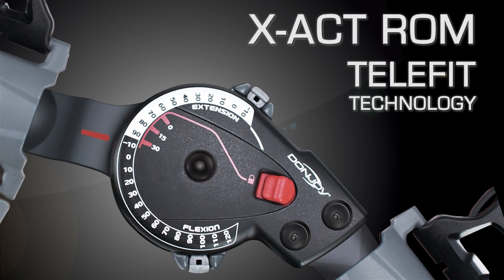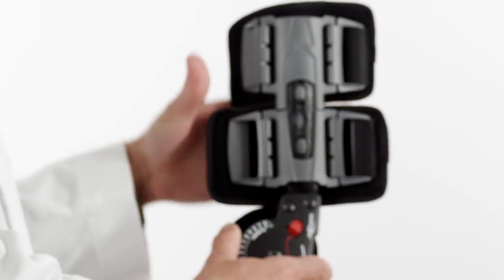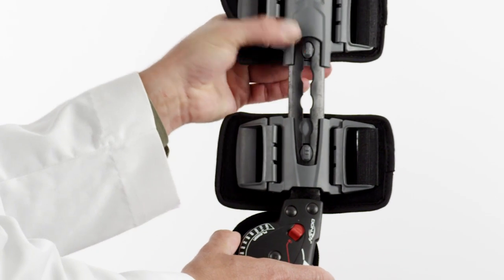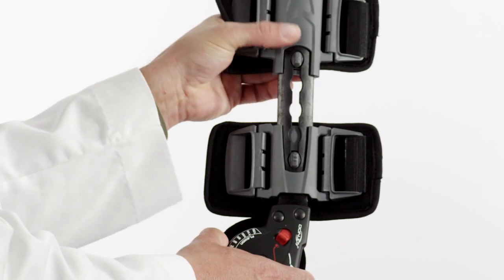TeleFit technology enables each of the four straps to telescope independently, so you can keep the straps away from the surgical site. To adjust the brace, depress the slider button to telescope the paddles. Make sure that both bars are equal in length and that each strap paddle is indexed to the same position on each upright.